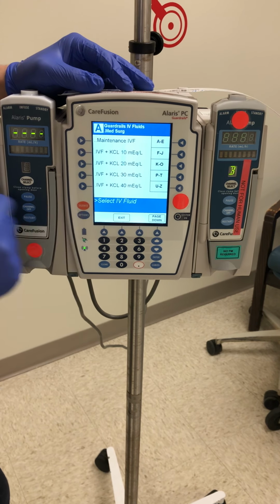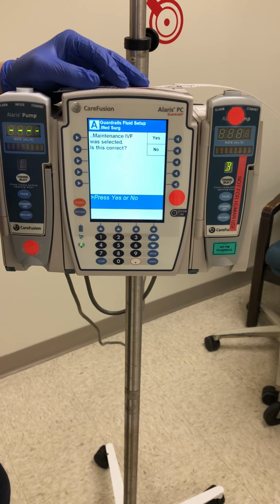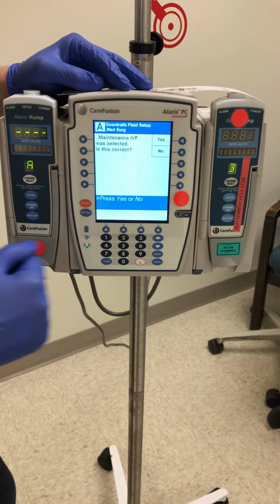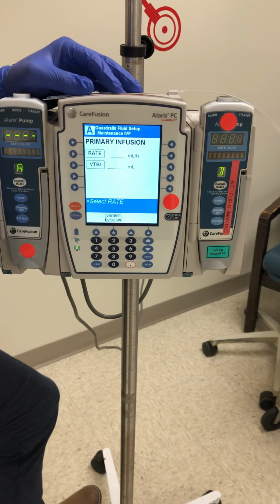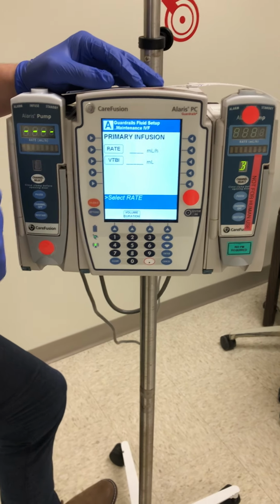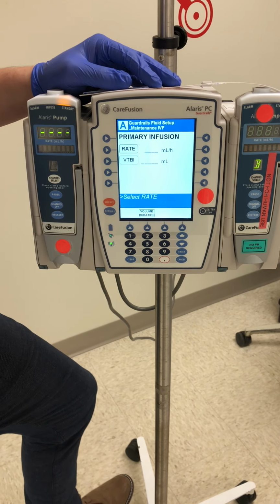So I'm going to toggle back up and I'm going to select maintenance IV fluids. It's going to ask me to confirm I am administering maintenance IV fluids. I'll hit yes. And then you'll come up with the rate and the volume to be infused. So we want to confirm with our physician's order what the rate is going to be, and we'll discuss that a little bit further when I show you how to prime primary fluids.